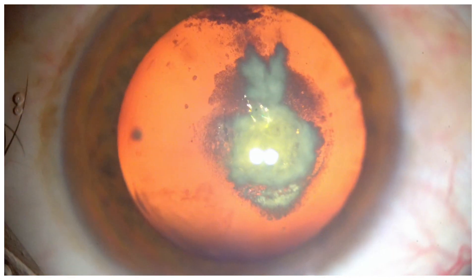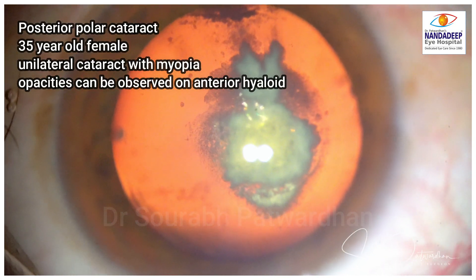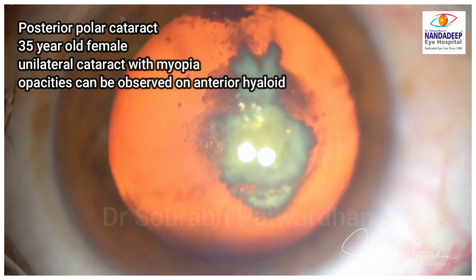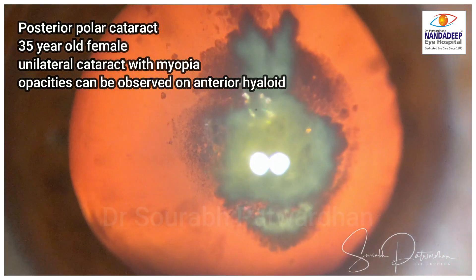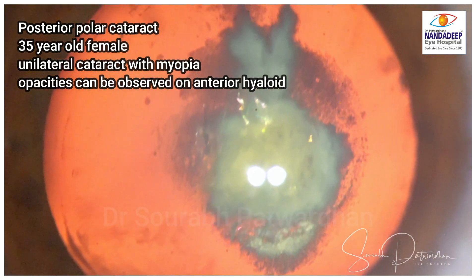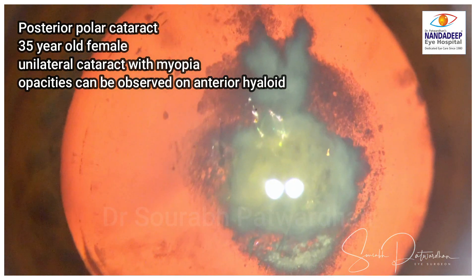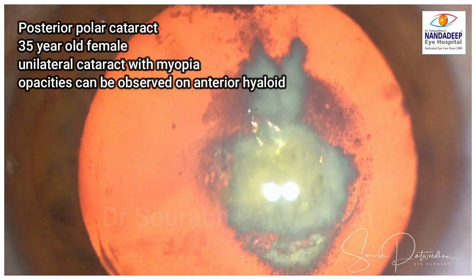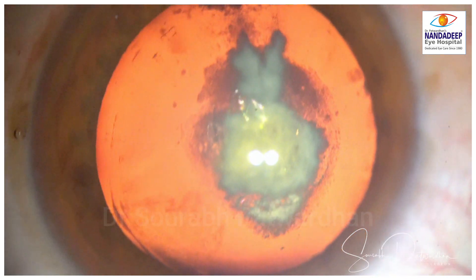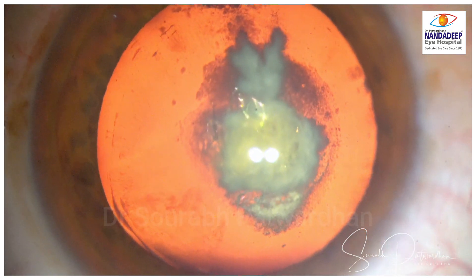This is a case of a 35-year-old female with posterior polar cataract, unilateral cataract with myopia. You can see the opacities which are observed on the anterior hyaloid — these opacities are behind the posterior capsule, so we expect that there is a breach in the posterior capsule.